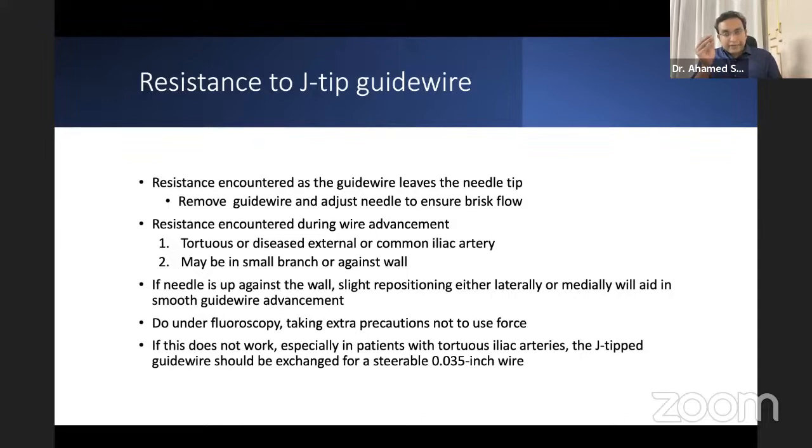If there is difficulty with the guide wire leaving the needle into the artery, remove the guide wire and adjust the needle a bit, because maybe the beveled edge is upside down, or it may be touching the wall of the artery. So adjust the needle, just torque it, and then try to put the guide wire in.